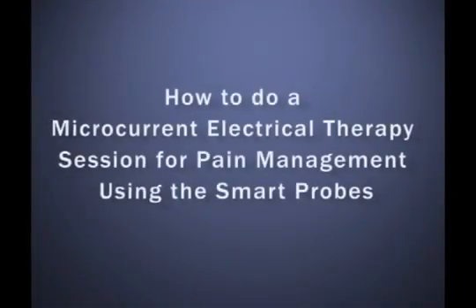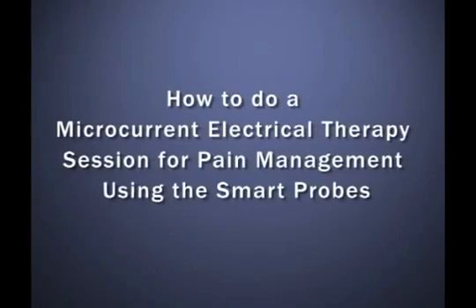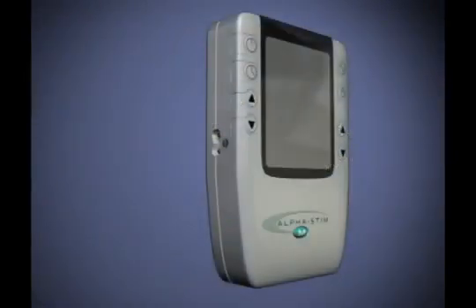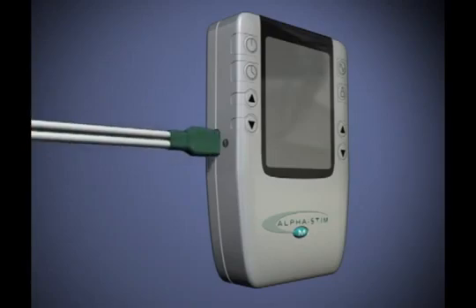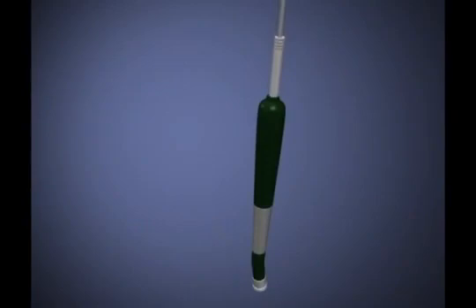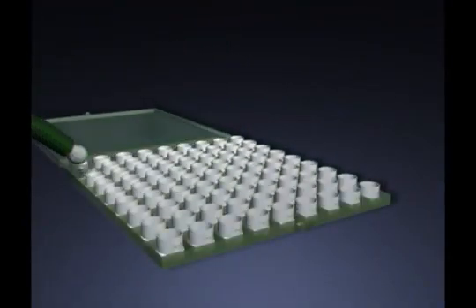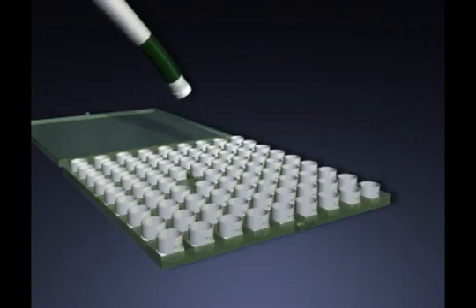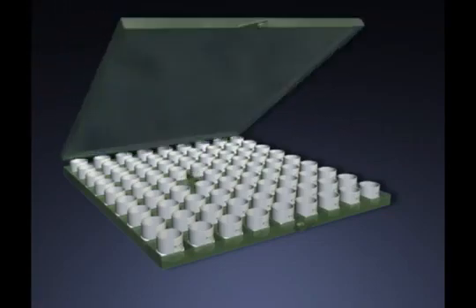How to do a microcurrent electrical therapy session for pain management using the smart probes. Plug dual connector end of the wires into channel 1 or channel 2 and the pin plugs into smart probes. Apply probe electrode pads or PEPs to the probes by placing a clean probe tip into the PEP while the PEP is still in its case.